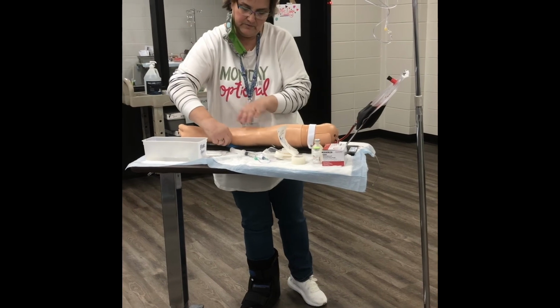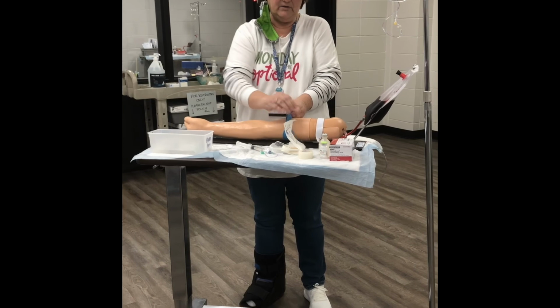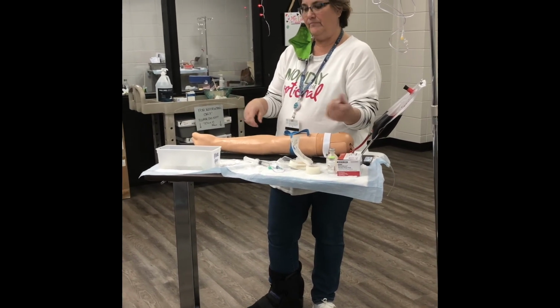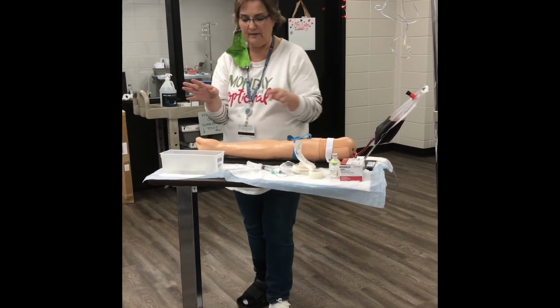All right, so you're going to put the tourniquet on, tight enough that you're occluding the vein, but you don't need it to be turning blue. Try to get these to go at the end of the arm, because if they flop this way after you've cleaned your area, you've got to clean it again, all right?